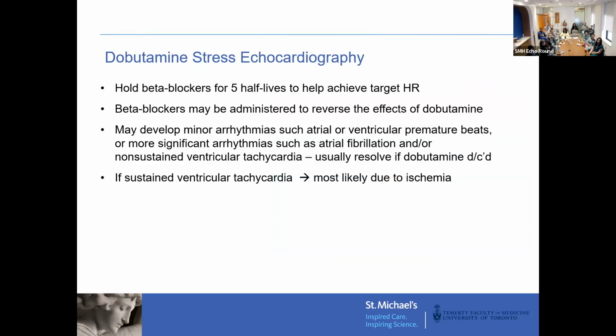Just some quick tips on dobutamine, and particularly dobutamine stress echo. If the patient is on a beta blocker, you want to make sure you hold that for 5 half-lives. So, patients who are on bisoprolol, for instance, that's quite a lot of days. So make sure that you're trying to do that. That's typically a bit challenging to achieve, practically speaking, in certain patients, but that's the gold standard.